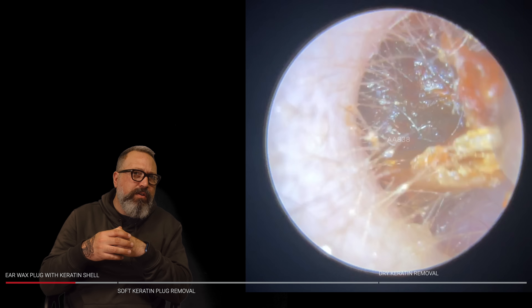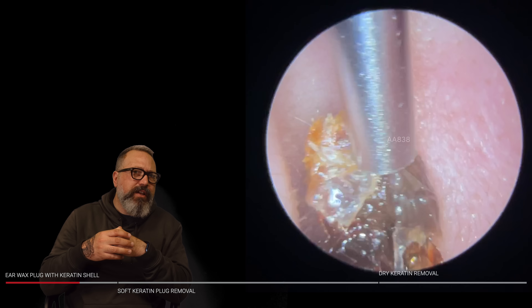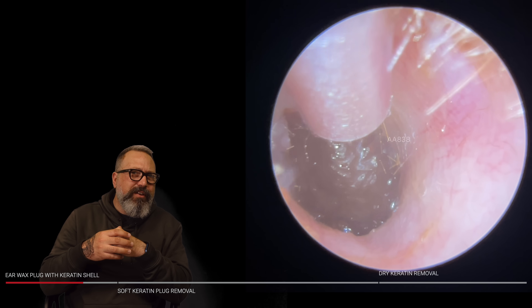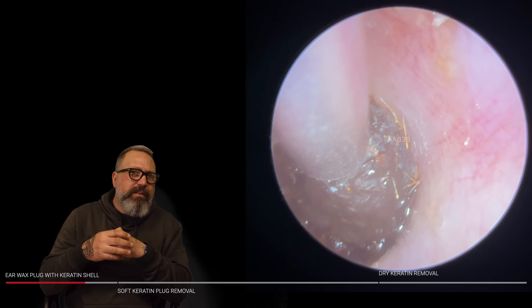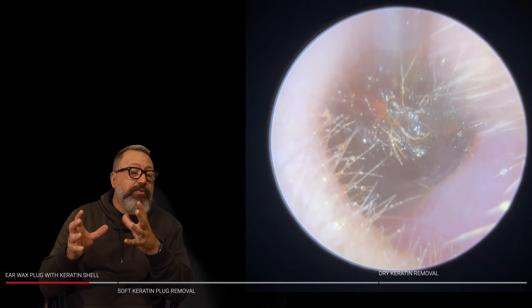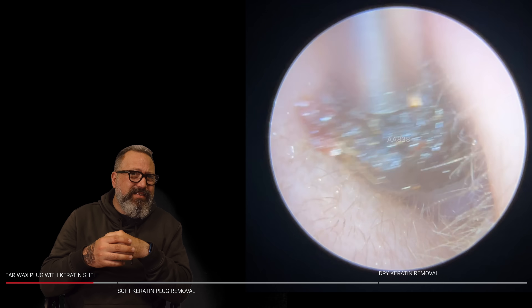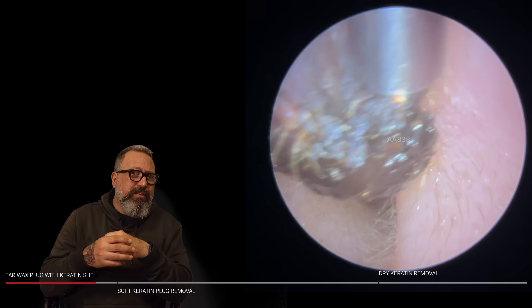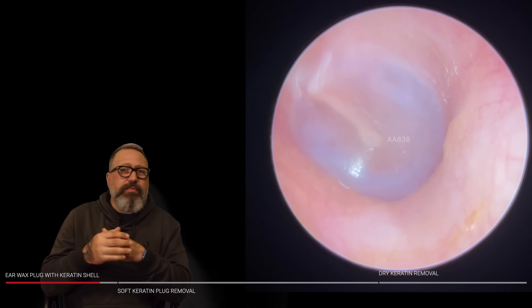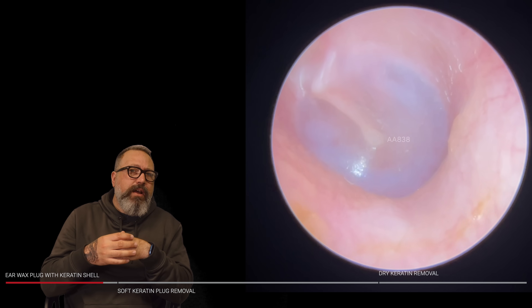That is holding on. There we go — we've just pulled that section. Looking in that canal, there's a very, very deep section still remaining. That's a lot easier now. Basically this keratin shell was sitting around the outside edge, stopping the wax plug from migrating out, and it's dried out in place. You can see the consistency — wax when it gets older almost has this sort of matte appearance to it. Eardrum looking absolutely spot on there, though. You can see that keratin layer at the entrance and then that much deeper section.